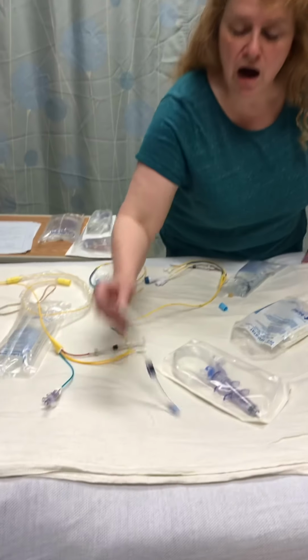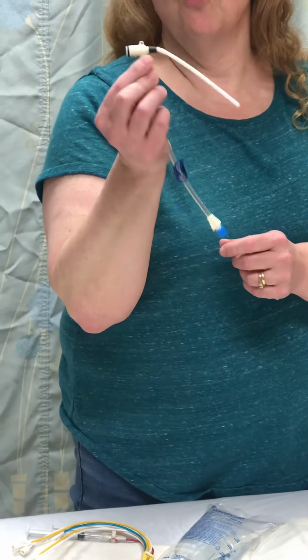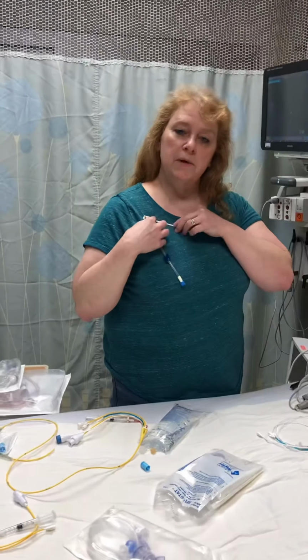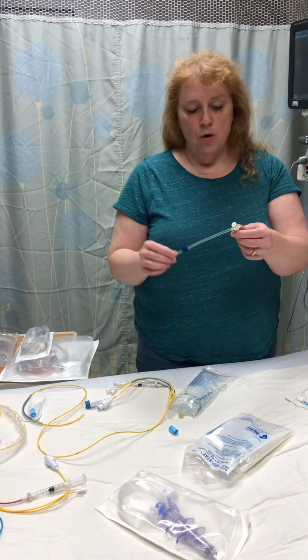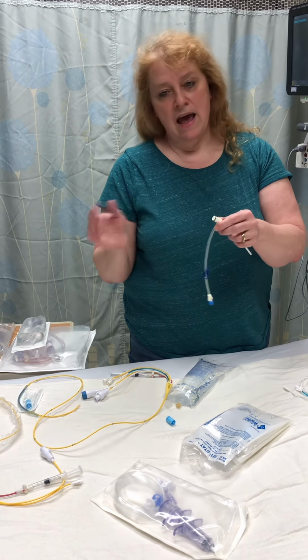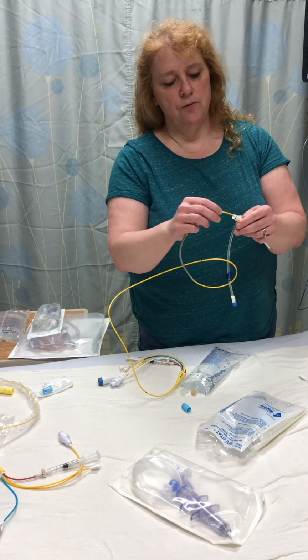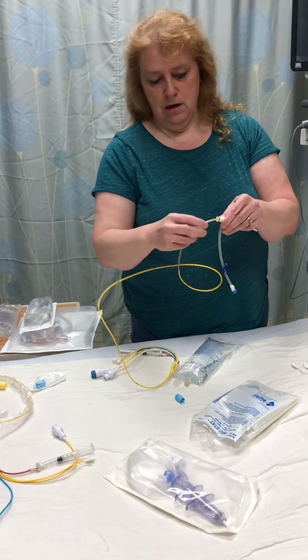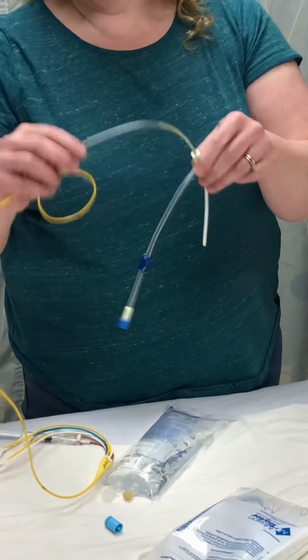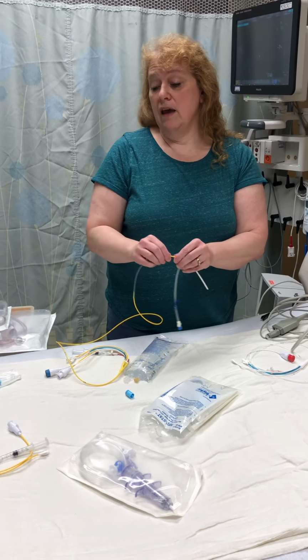So for our Swan, the physician's first going to put in an introducer or a Cordis. It's going to go up here, subclavian or IJ, and after they get this in, they're going to take the Swan and thread it through here, and then it's going to go to the appropriate place.